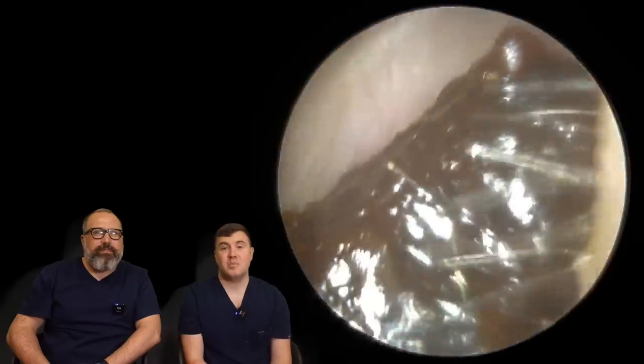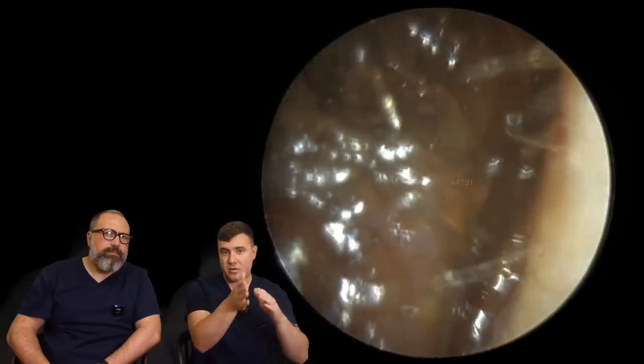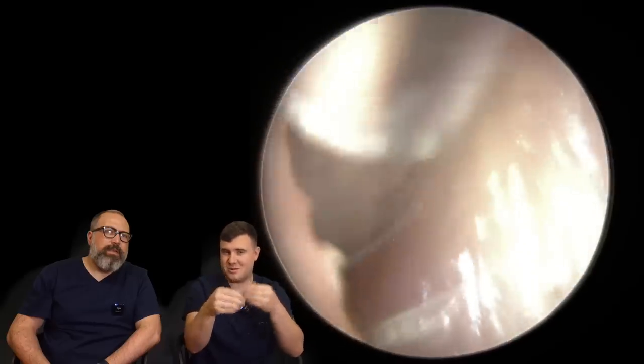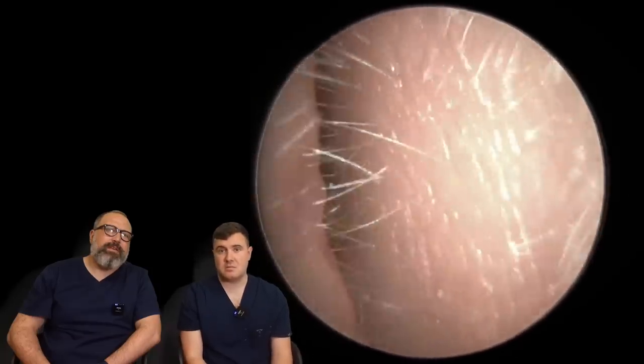So I think we're done with the last patient in this compilation — this is yours. Very, very narrow canal and a dark plug of wax in this one. These are generally quite difficult to do. This is my view without pulling the ear — there's barely anything; this ear canal is almost completely closed up. What we've had to do is pop the camera in first and actually hold the ear canal open with the endoscope. Some oil has been used in this case. We're actually using the fine-end suction tube here, purely because of how narrow this ear canal is.